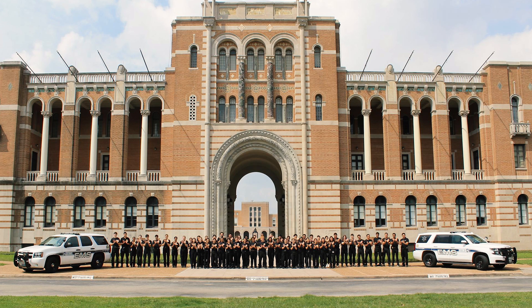I'm a Rice student first and foremost, but I'm also a member of Rice University Emergency Medical Service. We have our own EMS service on campus, and I've actually had to use one of these devices on a real person before. It was during one of my training ride-outs with one of the Houston area fire departments.